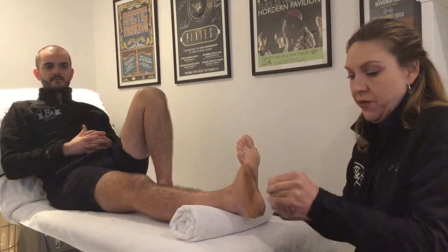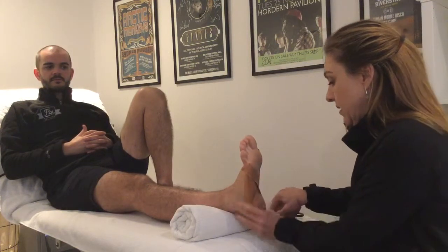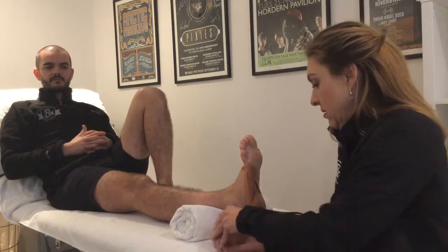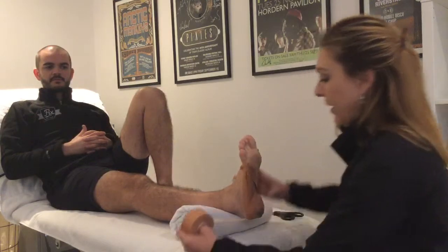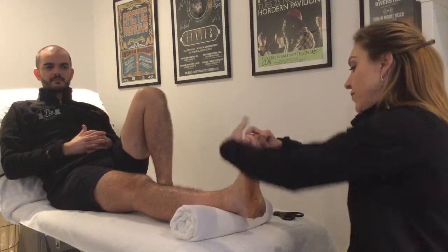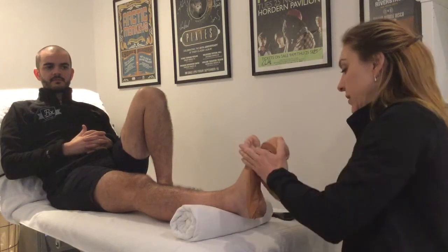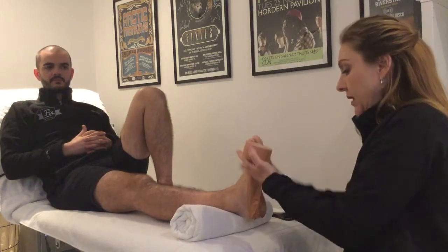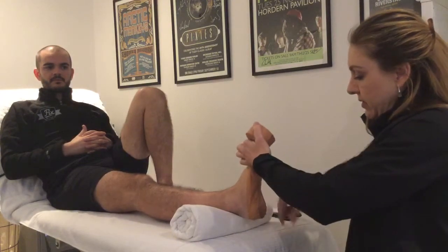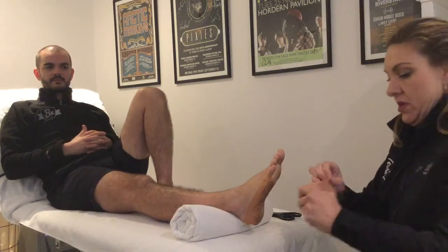This can just give an injured plantar fascia a little bit of time and space to rest. Then we go back in the opposite direction, and at the end of the figure eight we do an anchor.